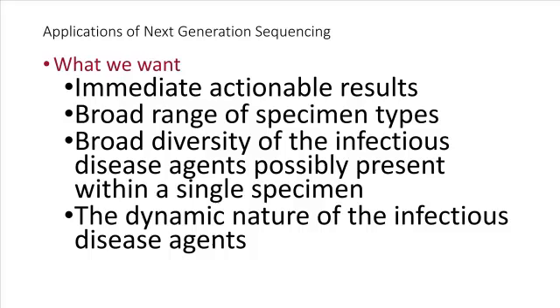We want to find everything that's in the sample and correlate that with the clinical presentation. And we also want to understand the dynamics of the infectious diseases present. How are they going to act? How are they going to interact? What kind of prognosis or predictions can I make from these findings?